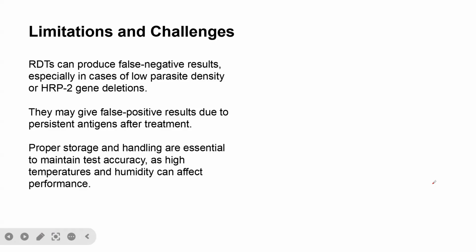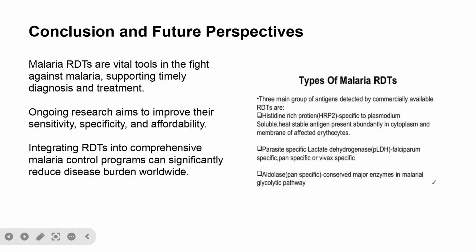And then proper storage and handling are essential to maintain test accuracy, as high temperature and humidity can affect performance. So in conclusion, malaria RDT tests are vital tools in the fight against malaria, supporting timely diagnosis and treatment. Ongoing research aims to improve their sensitivity, specificity, and affordability. Integrating RDT into comprehensive malaria control programs can significantly reduce disease burden worldwide.